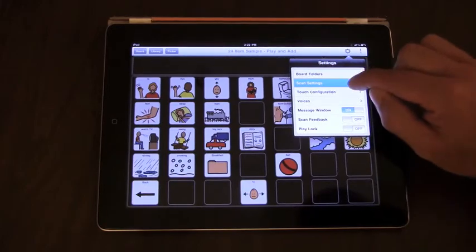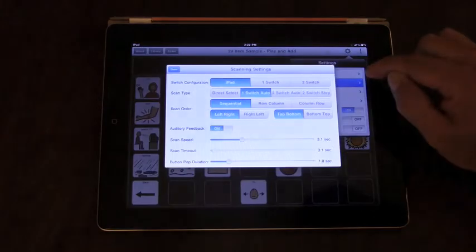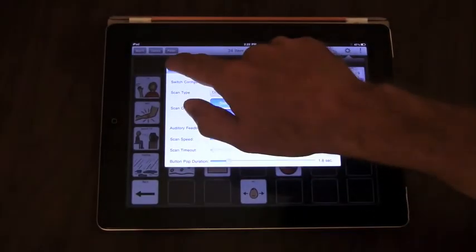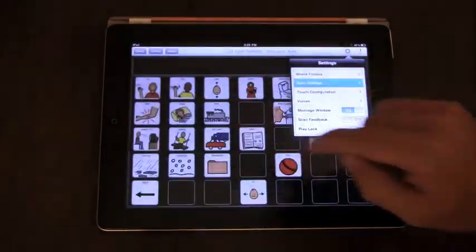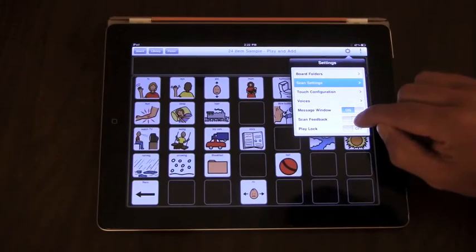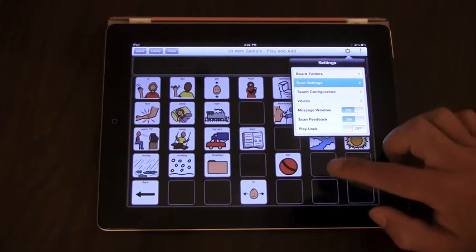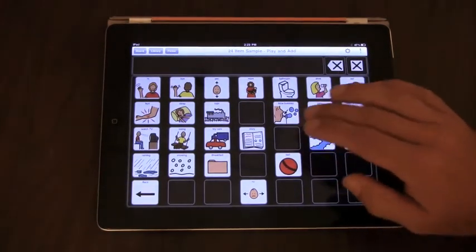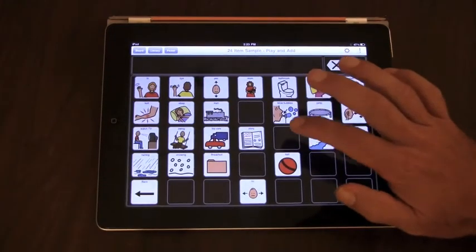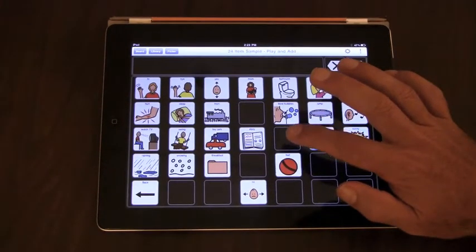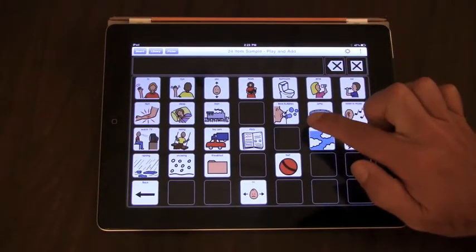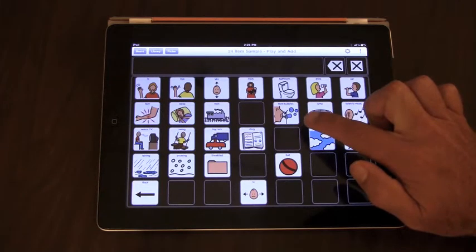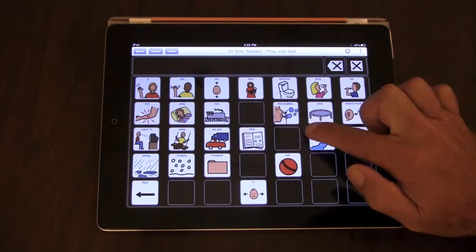So let's try this with the auditory feedback turned off and the scan feedback turned on. Well, here are just sounds to indicate scanning through different items on the app.